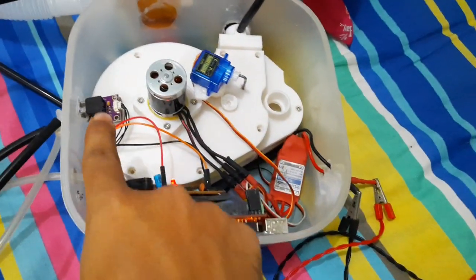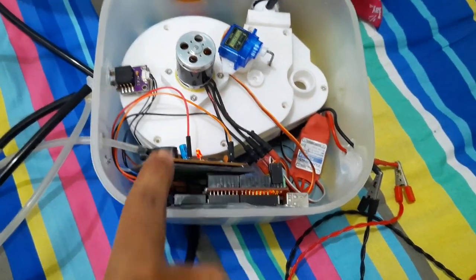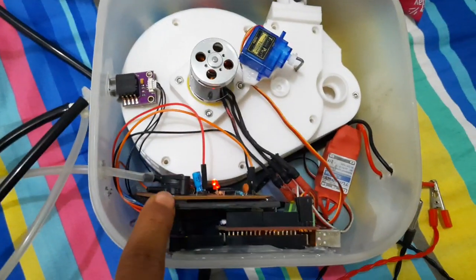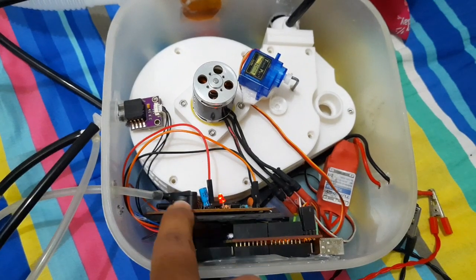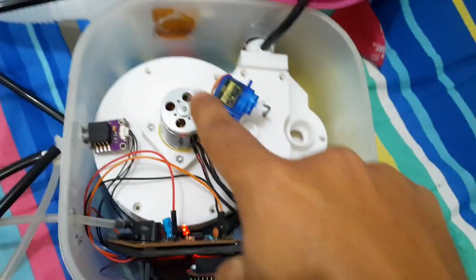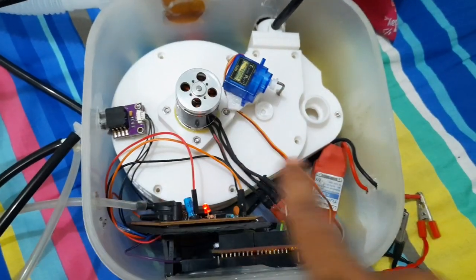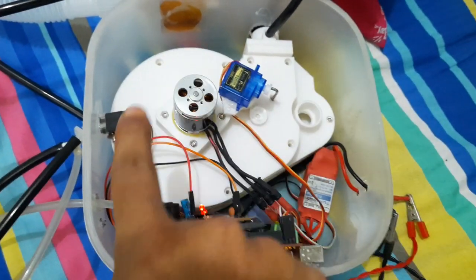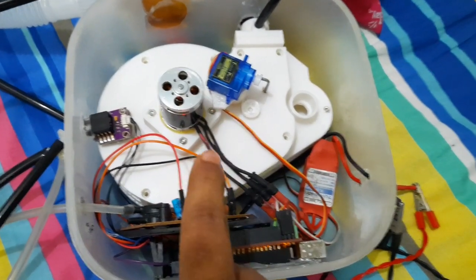So this is the MPXV7002 differential pressure sensor. Another differential pressure sensor is here. This is for flow measuring, and this is for pressure sensing. So this is the BLDC motor, and this is the actual turbine. The whole turbine is designed by CRUX.